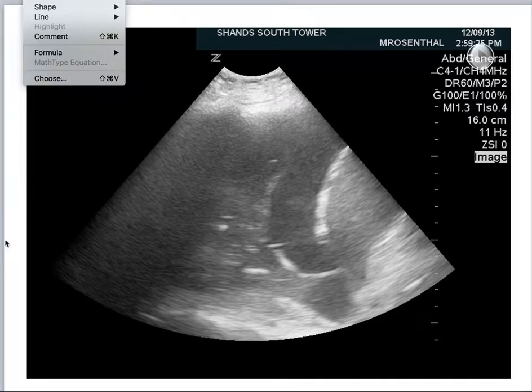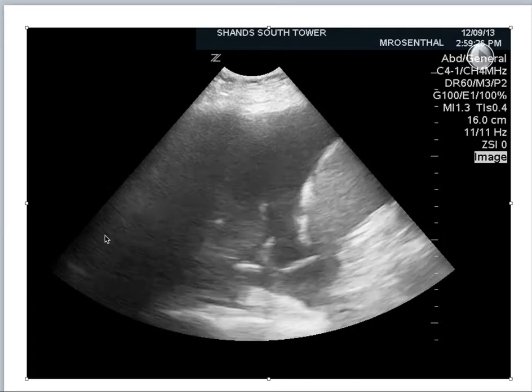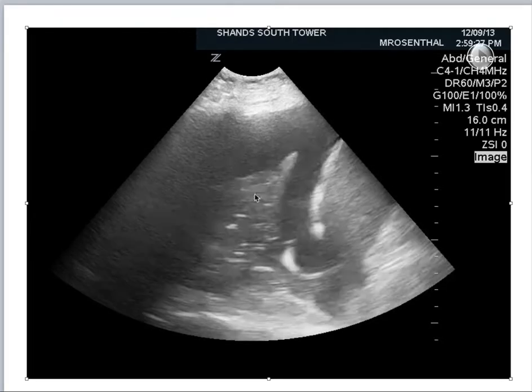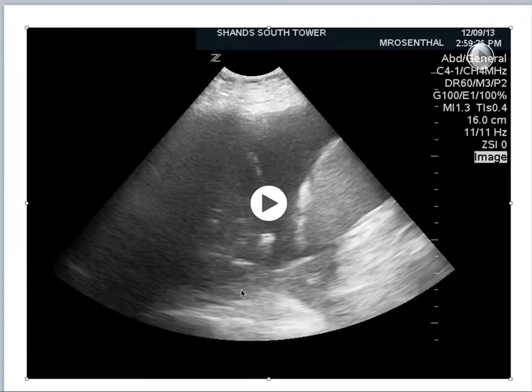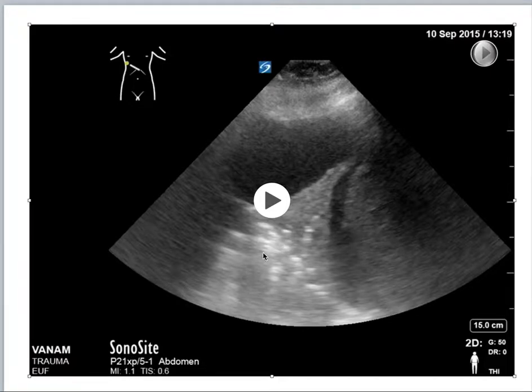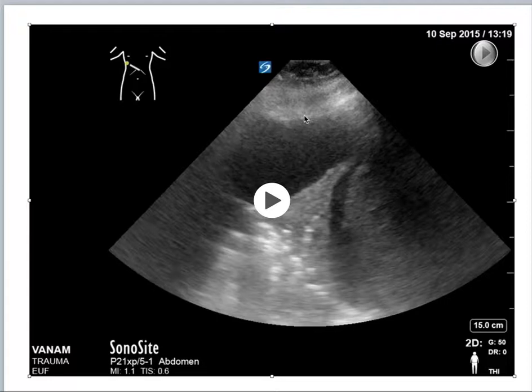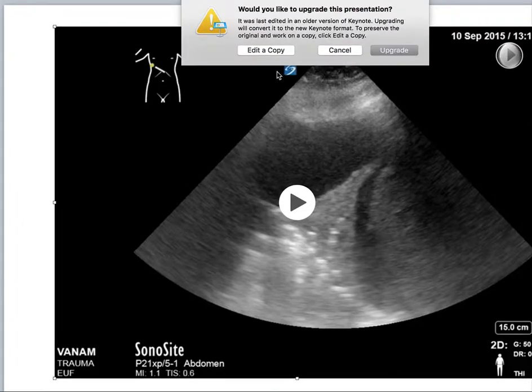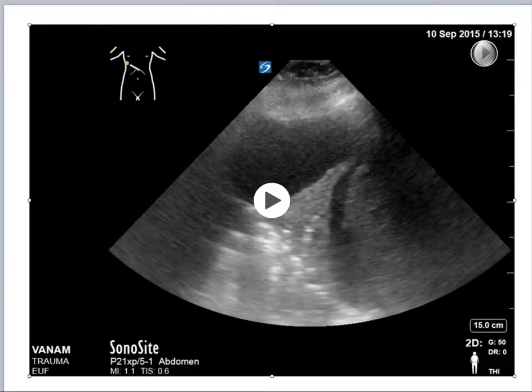Here are a few more pleural effusions to review. This one is probably a moderate pleural effusion — you see the diaphragm, the pleura, and no fluid inferiorly. This next one shows a large pleural effusion with visible liver or spleen and the lung with possible air bronchograms, which we'll cover more in the pneumonia section. If you were to measure this, you would measure from where the chest wall ends to where the fluid starts, because your needle would take that path for drainage.